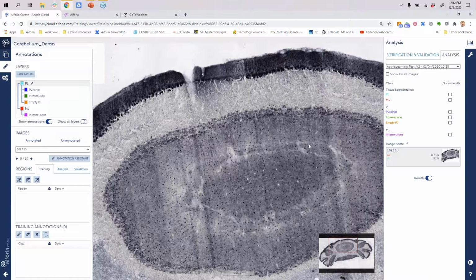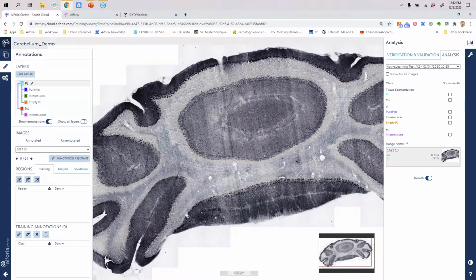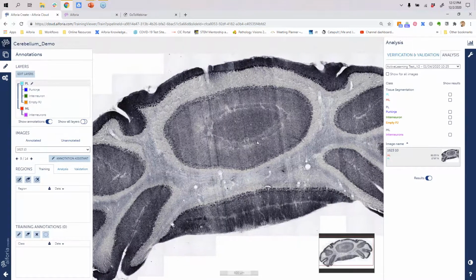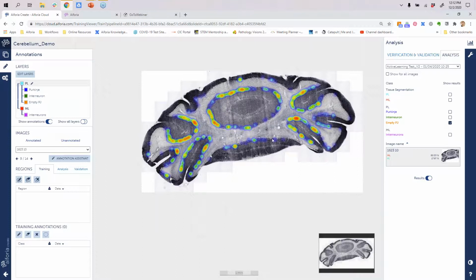And so we're now beginning to discover, this investigator is actually looking into the function behind these different cell populations using electrophysiology, but they also wanted to know, is the distribution pattern of these different cells in the cerebellum within the slice? So consistently throughout the different bregma levels of the cerebellum, they made this finding. They found that these darker cells, these more filled cells, and you can see by the heat map, they more localize laterally and towards the outside of the slice, whereas that empty cell population that stains with the same stain is more central and towards the inside of the lobules, which was a really interesting finding.